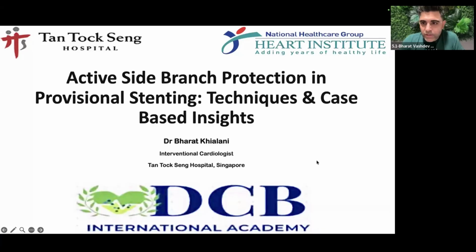Perfect. So the idea for this, I think Iman asked me if I would be willing to talk about this active side branch protection in provisional stenting. I posted a few cases on our WhatsApp where I do provisional stenting across major side branches and protect them.